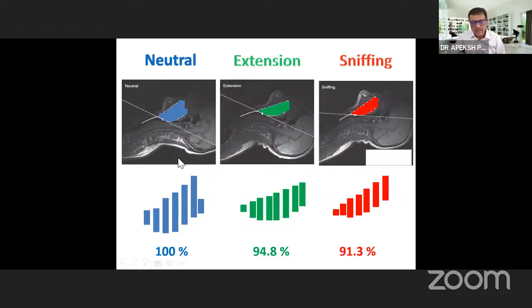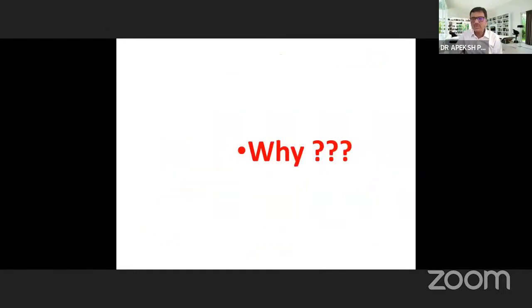And if you look at the direction of the tube or channel for the passage of the endotracheal tube, in neutral it is angled. But if you look at sniffing, it's straight. So that is the reason we should use sniffing position for direct laryngoscopy. One, it decreases the submandibular tissue area and decreases the force of laryngoscopy, and it provides a direct channel for the passage of the endotracheal tube compared to neutral position. And that is the reason we should use sniffing position, not other positions.